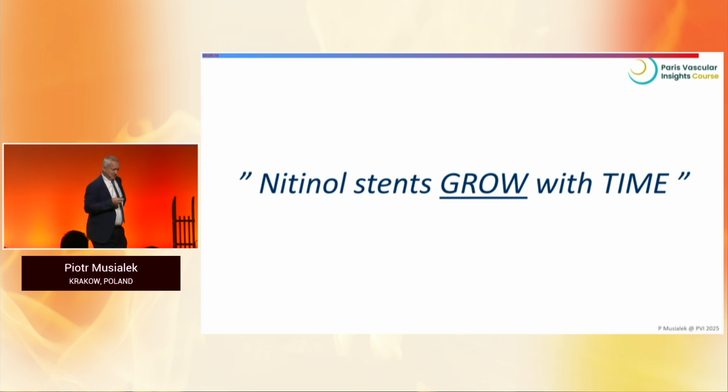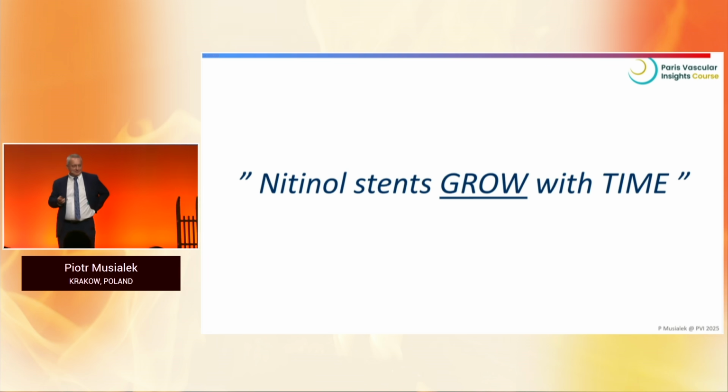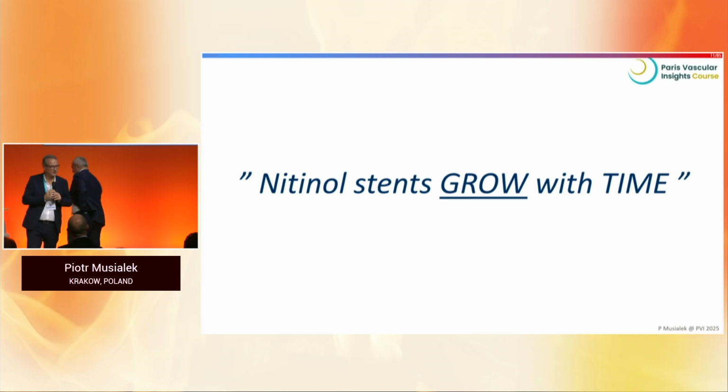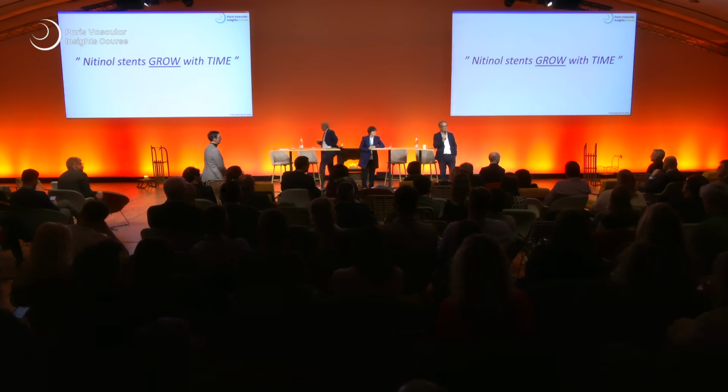And this has been pretty well shown by Samira's book. In calcium, that is different. Okay. If you don't treat the calcium, the stent's not. Exactly. But these self-expanding nitinol stents, they do continue to expand. Where they can. And which type of stent? The old one or the Wallstent, for example? Yeah, we don't use the Wallstents.